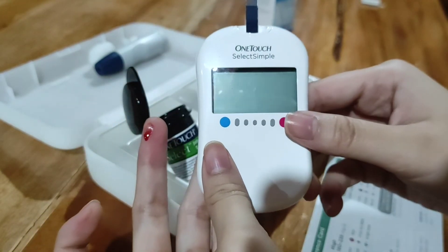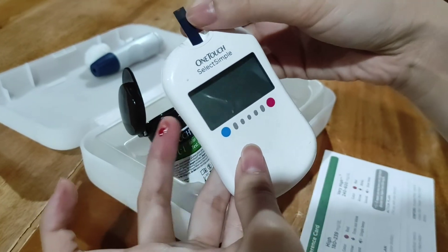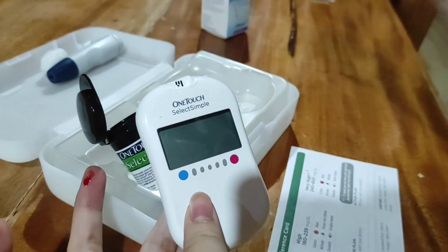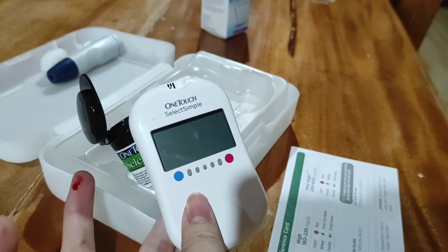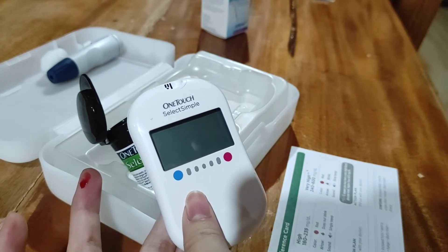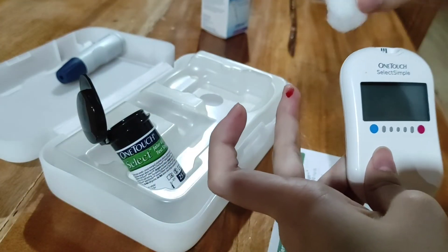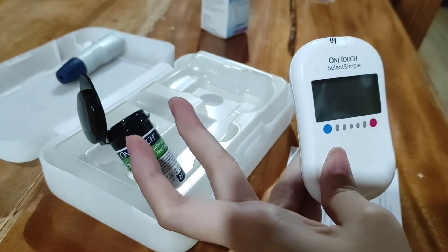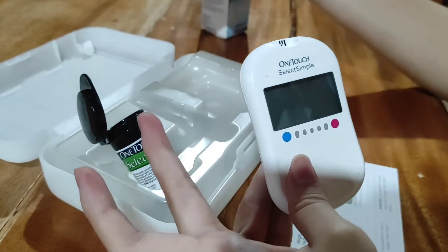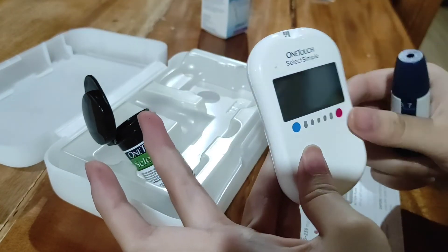After that, you're going to discard the strip and put it on the proper waste receptacle since it is a bodily fluid. And then disinfect. You're just going to discard the other materials and also disinfect.